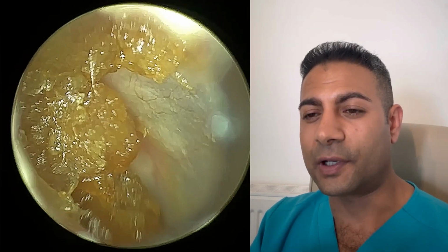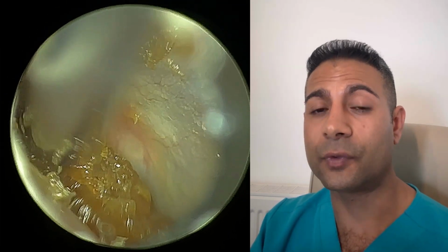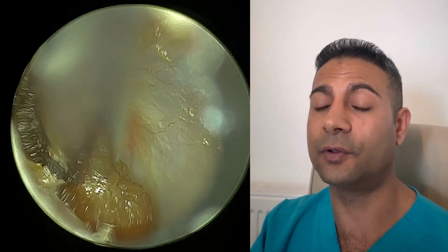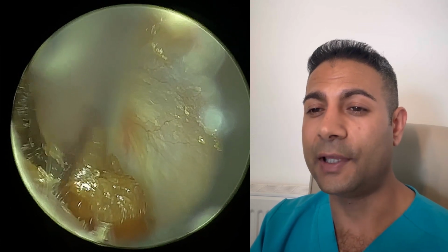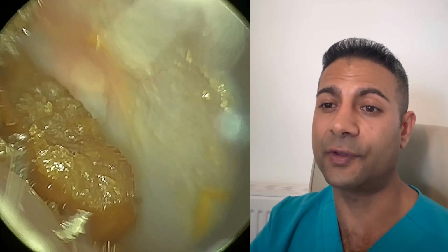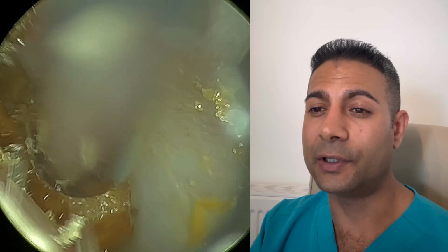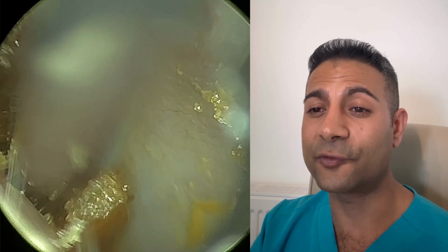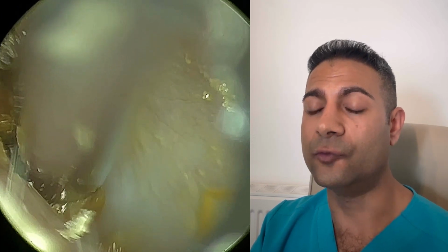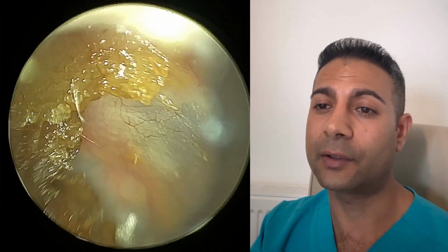But one of the advantages of the WAXscope app is that we can really zoom in. Now, if you over zoom, the image will be a bit grainy and not so clear. So you don't have to over zoom, you only have to zoom in a little bit, but it did really help zooming in when I'm working against the eardrum. As you can see now, it just brings the wax in focus, but it also allows me to more accurately position and place the suction tube. You can see how close we are to the anterior canal wall here, and that zoom just really helps me to avoid making contact with the anterior canal wall and just make contact with the wax.